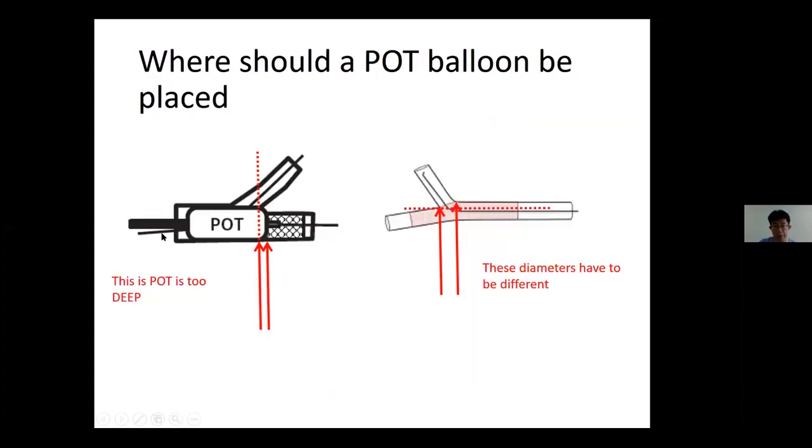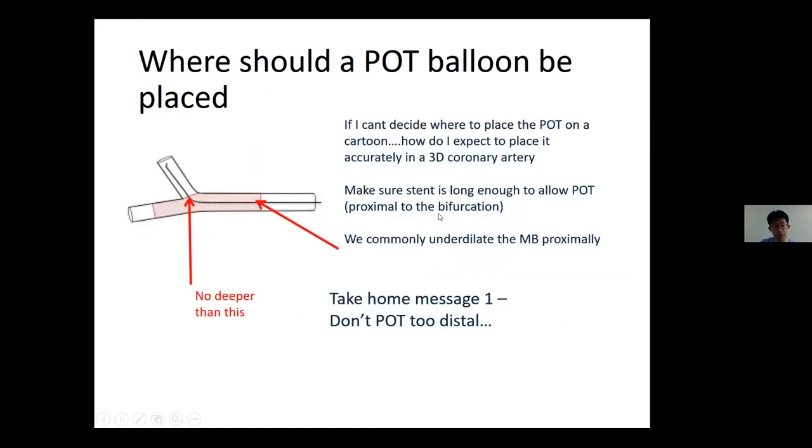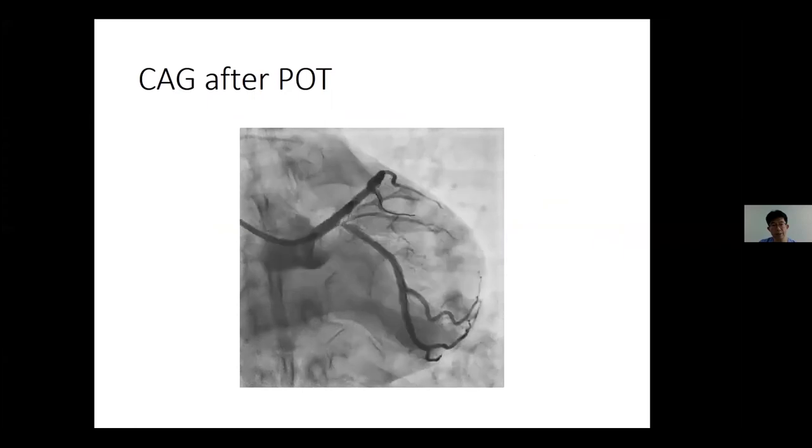This is the same image. This POT is too deep here. The POT balloon position is here, very difficult, very important. Don't do the POT technique too distally, it's very important. This is the CAG after the POT technique.